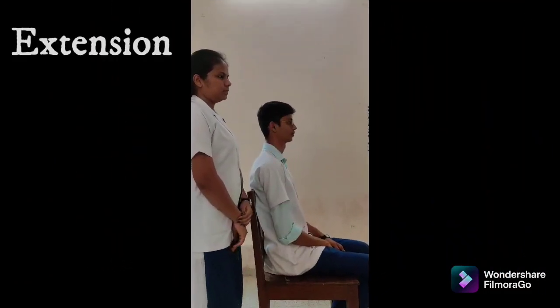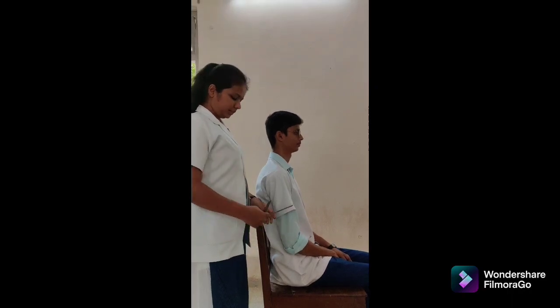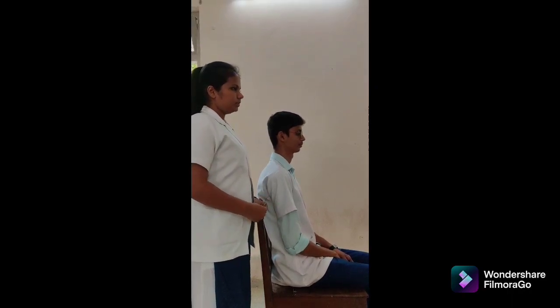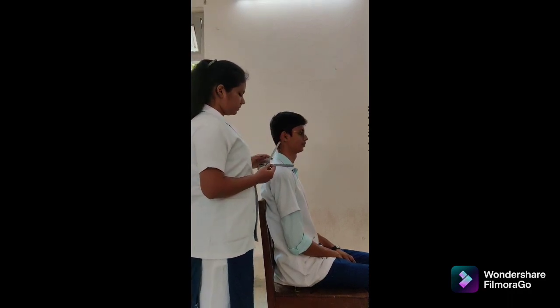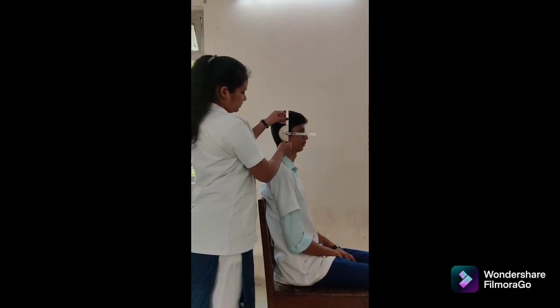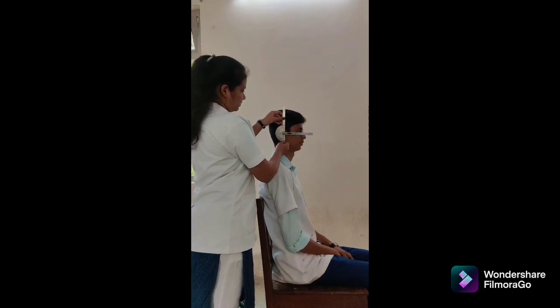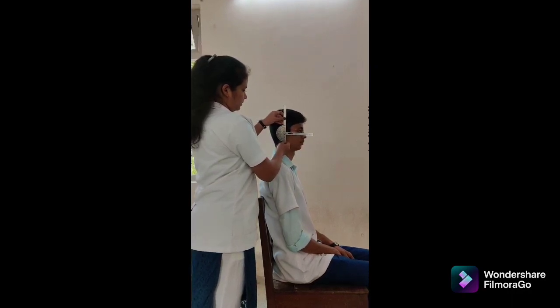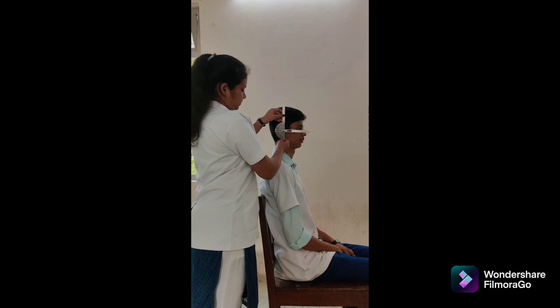We are going to perform cervical extension with universal goniometer. Patient position: high seating with thoracic and lumbar spine supported by back of chair. Goniometer alignment: fulcrum over the external auditory meatus, stable arm perpendicular to the ground, movable arm parallel to the tip of nose. As the patient bends the head, the movable arm moves with the movement. Normal range of motion is 0 to 50 degrees. Instruction to the patient: move the head into extension.